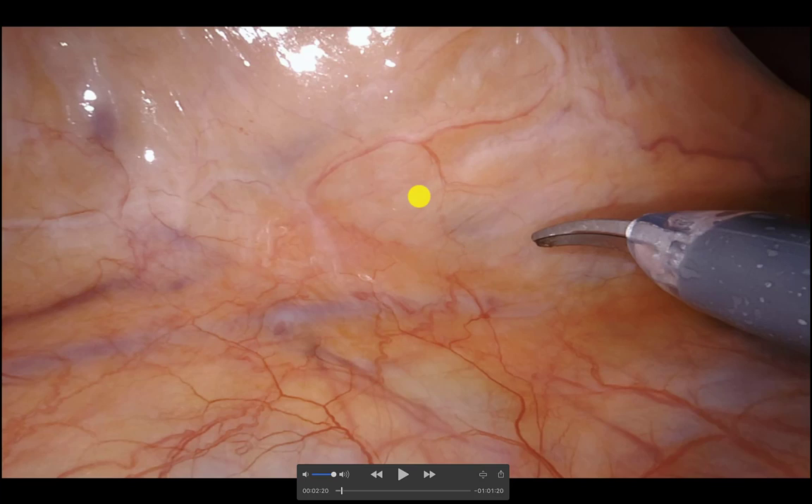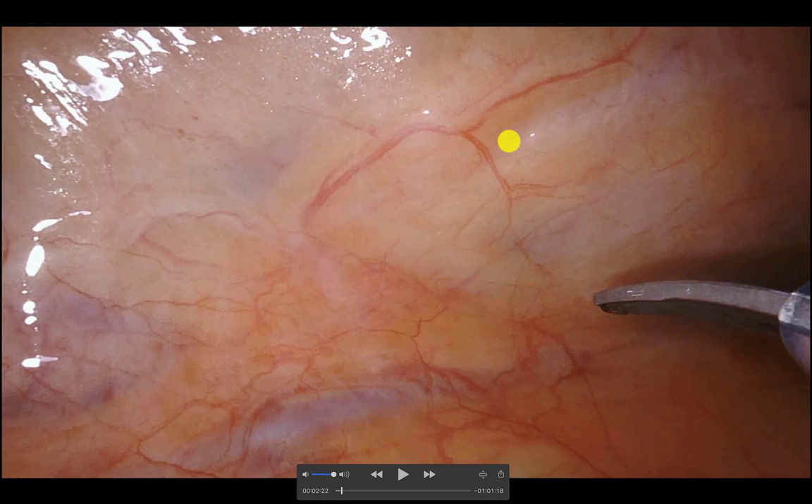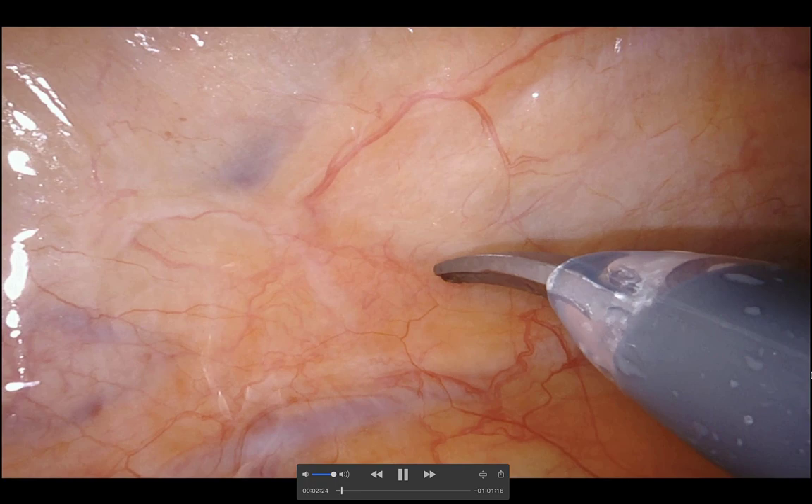You'll see the meso-rectum here in a light yellowish color versus a darker yellowish color in this patient. I'm jiggling the peritoneum trying to predict the junction between the retroperitoneum and the meso-rectum. That exact point along that line is where I'm going to make the medial-lateral incision.